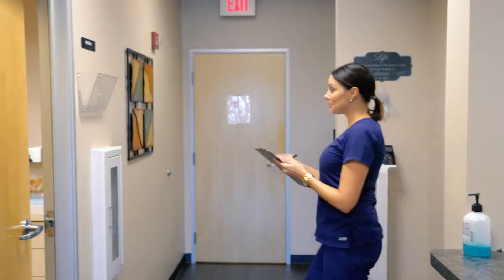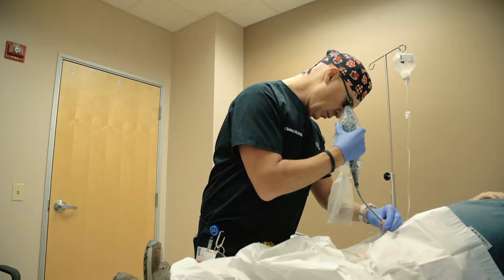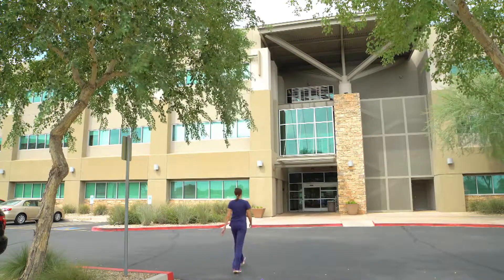The PrimeSight cystoscope with the endosheath has allowed us to not have to go through the traditional process of waiting for your other provider to have the scope ready. The mere concept of having to wait 20 minutes or 15 minutes is a nightmare. It really allows a rapid turnover system and allows you to also work with other providers in the office who may also need to use the scope.